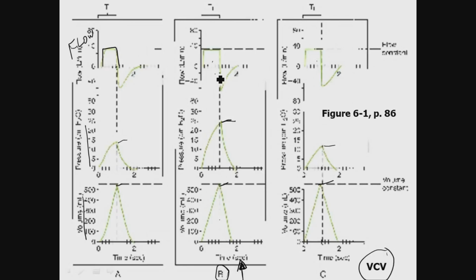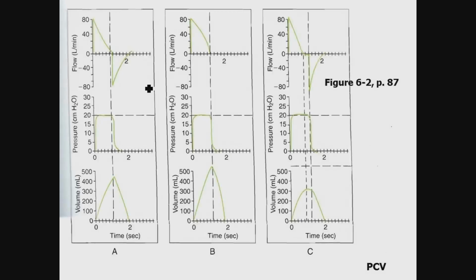Usually about the 75th time I say it, it's like, oh, now I get it. So it is purposeful. That's volume-based ventilation. In pressure-based ventilation, it's my pressure curve that is fixed, and no matter what happens, the pressure stays the same.